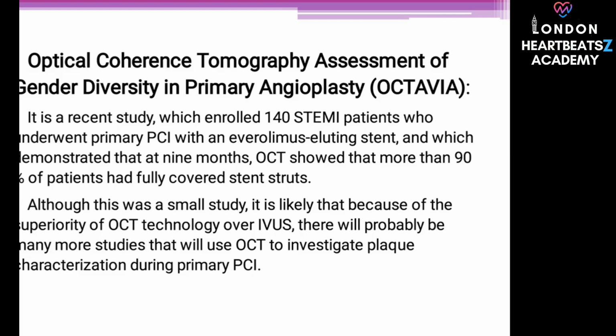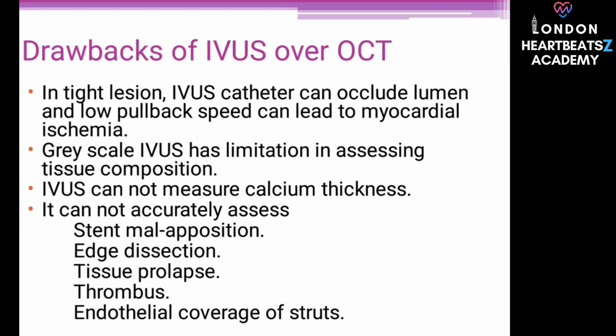That's a very accurate and important conclusion to draw. While OCT clearly offers significantly improved resolution and seems superior for distinguishing thrombus, dissection, and incomplete stent apposition, both IVUS and OCT are valuable tools, providing unique information for diagnosis, planning, and evaluating interventions. The review emphasizes that the question of whether routine use of either significantly improves overall clinical decision-making and patient outcomes is still being actively debated and investigated. Still debated. Yes. They are currently positioned as useful adjuncts to standard angiography. Whether OCT will eventually supplant IVUS as the preferred clinical tool remains open and depends on ongoing trial results.